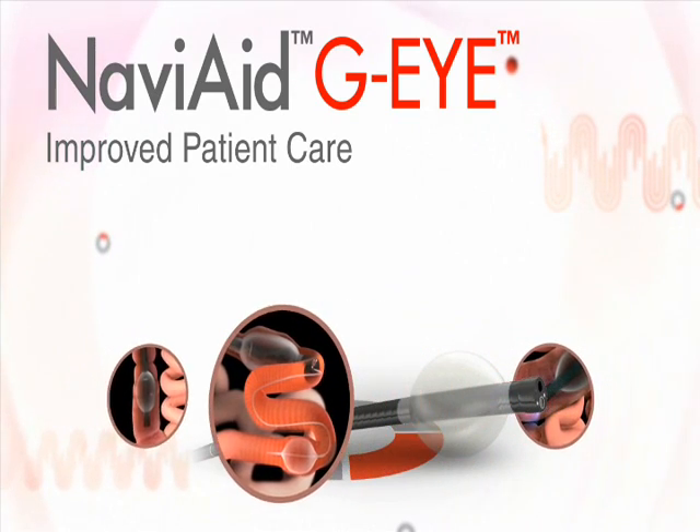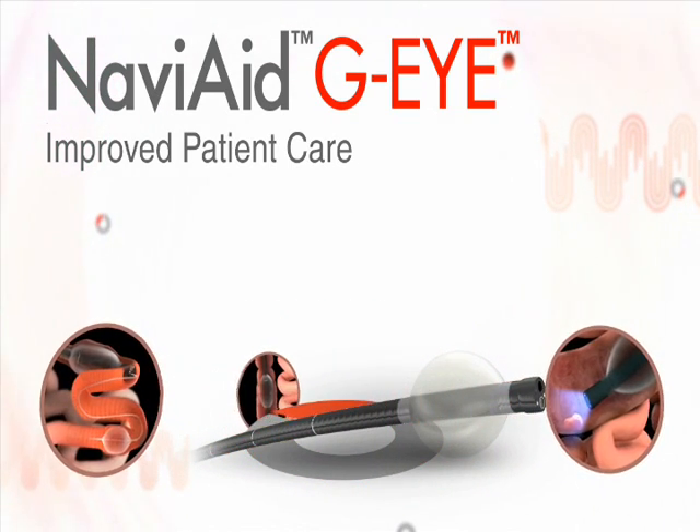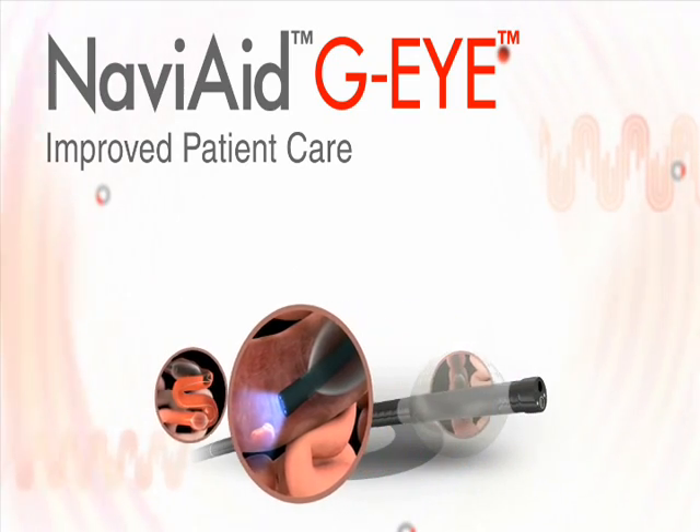It increases detection yield and is important in every colonoscopy, as well as in various other endoscopy procedures.